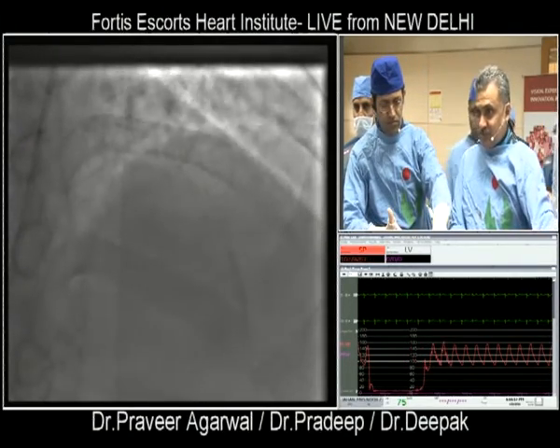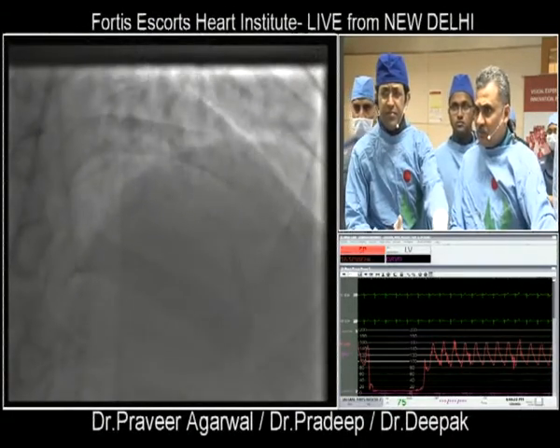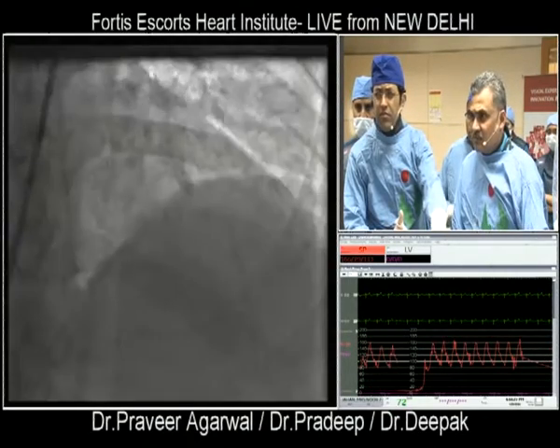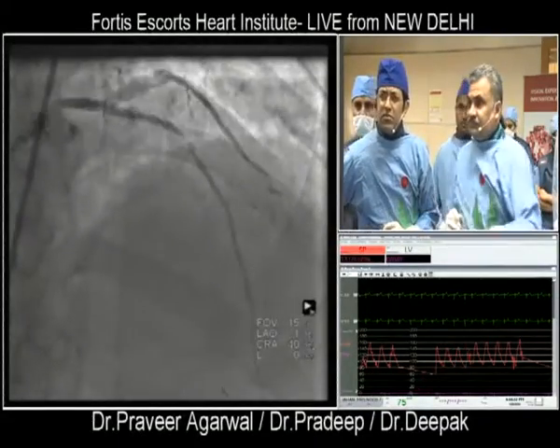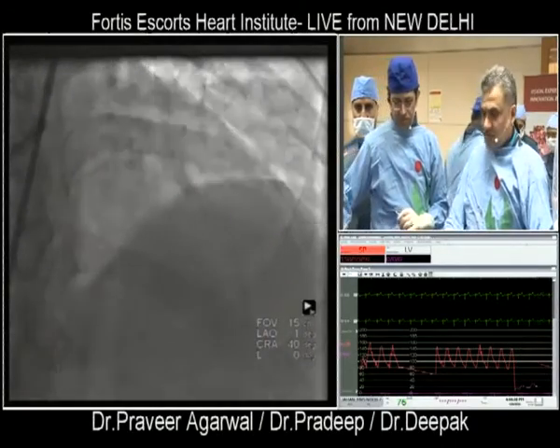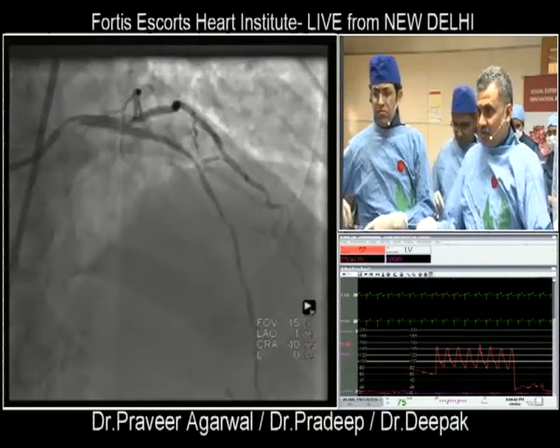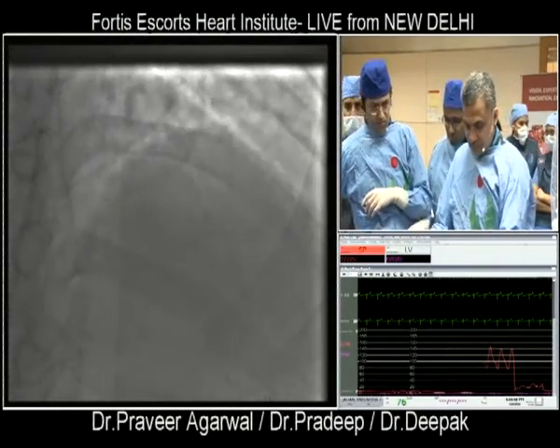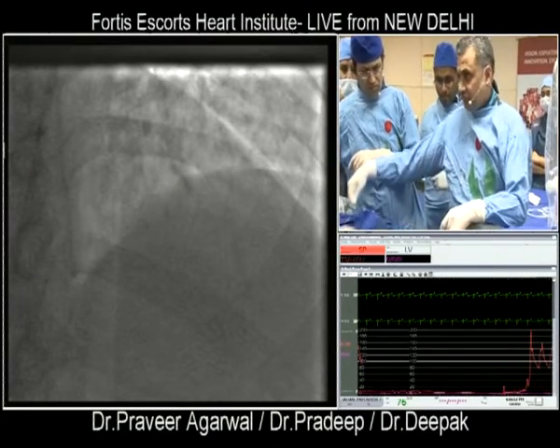I hope it flows. Guide, please. Check. Yeah, it's flowing. Can we have the Fielder XTR? Till now it is flowing. So I'm taking a Fielder XTR. Cine recorder, please.